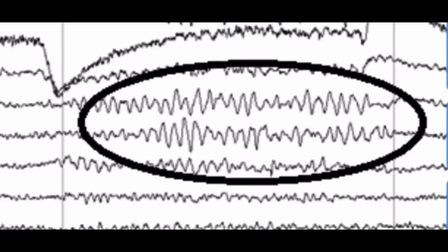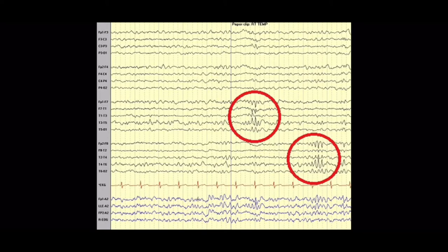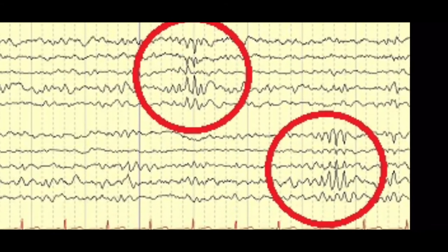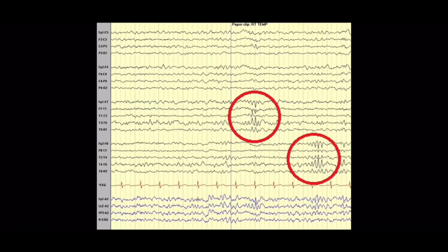Here's an EEG from the Epilepsy Foundation where the wicket rhythm is bilateral, happening on both sides, most prominent in the temporal electrodes. Zooming in, the bold lines are the one-second markers — counting the waves: one, two, three, four, five, six, seven — that's about 7 Hz, seven waves per second. That is definitely wicket rhythm, a good example to see it in another EEG.